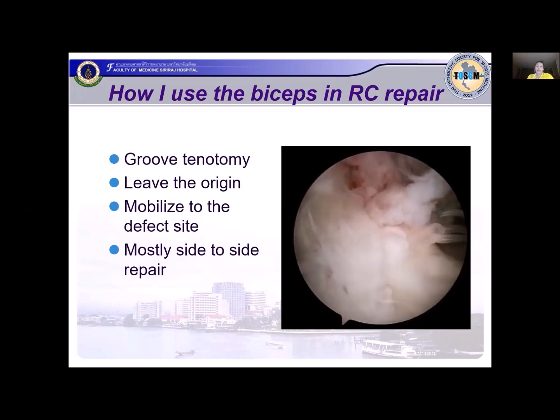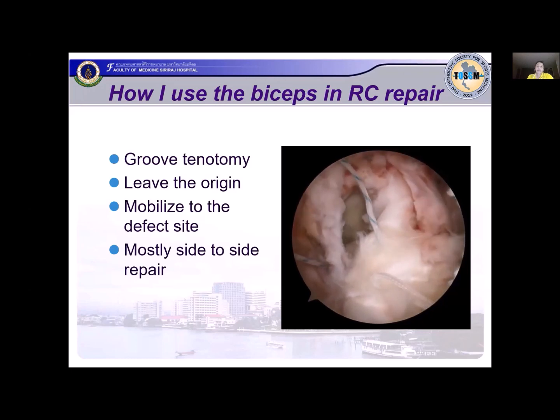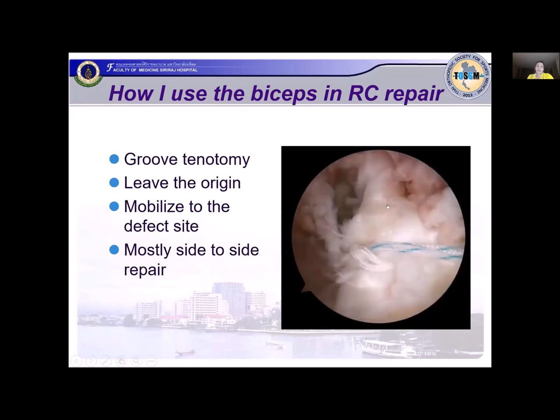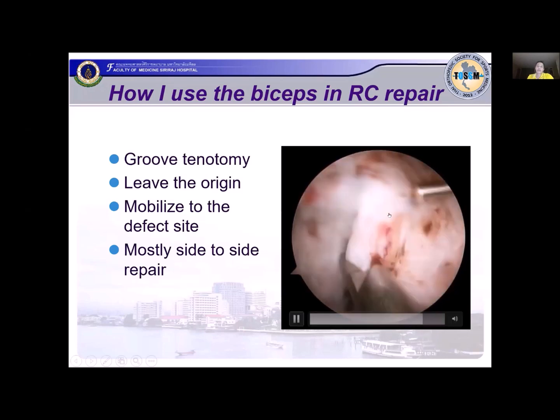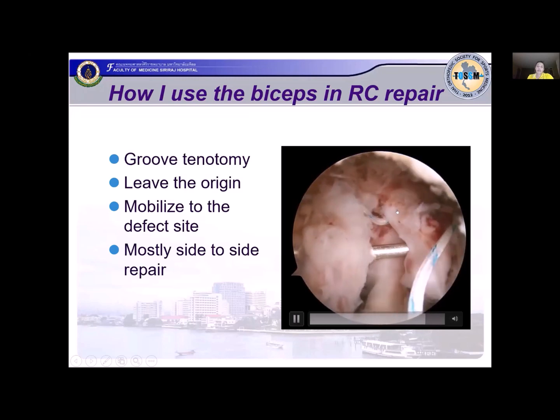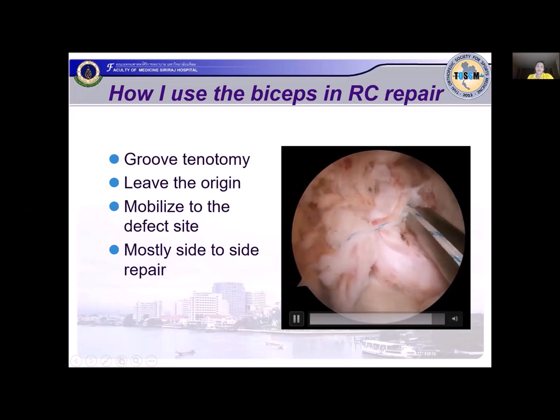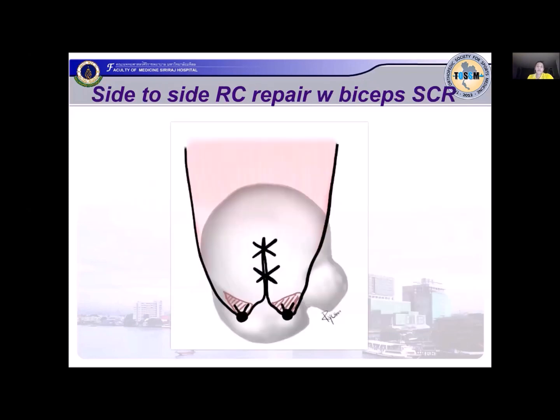After I tie it in the front and in the back, you see the defect at the proximal part. So you can add another side-to-side suture stitch like this, maybe one or two stitches. Right now the defect was closed, not like the usual side-to-side repair like this.